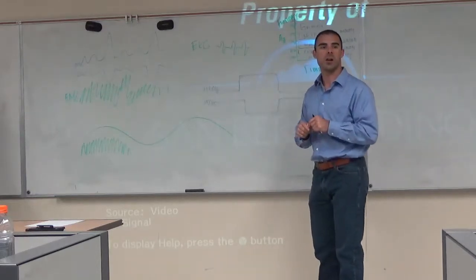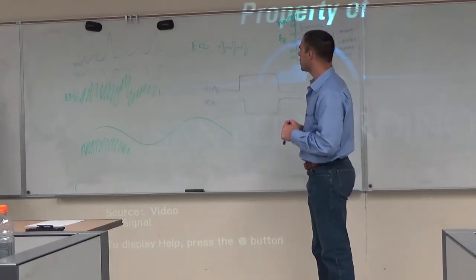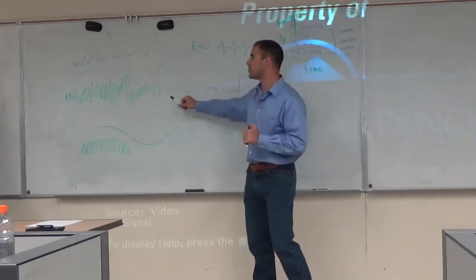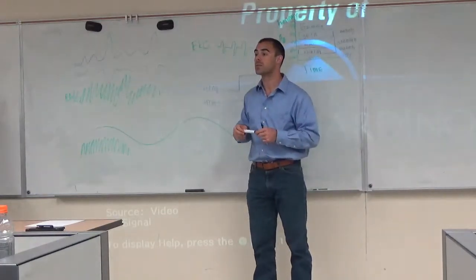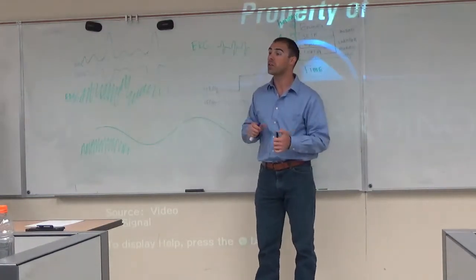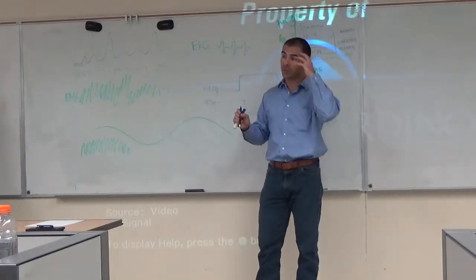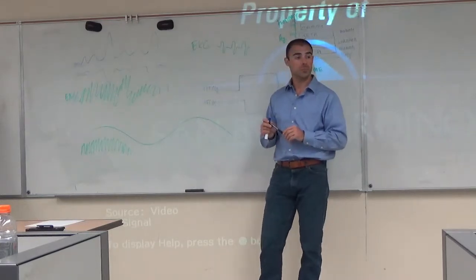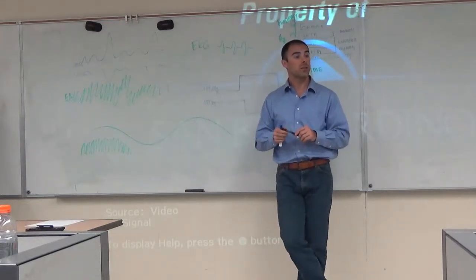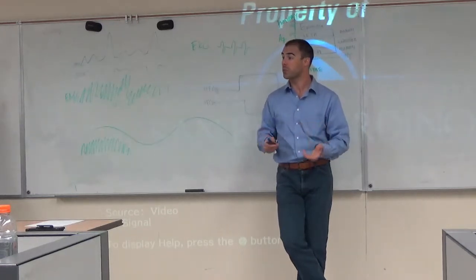Anybody have an idea for what you would do to deal with EMG? Yes, sir. Tell them to relax, yeah. You might instruct them: try not to clench your jaw. Try not to crunch your forehead. Yes? Like, don't react, like facial lines. Yeah, this is why we do those practice sessions, right? Practice with them about it.